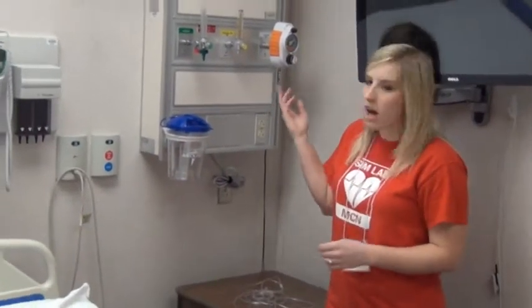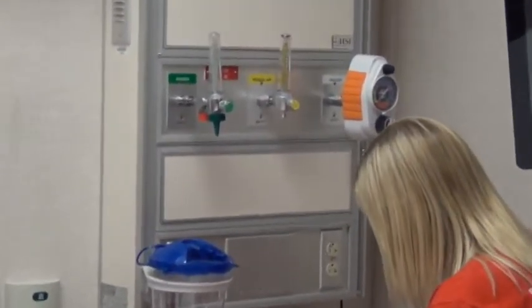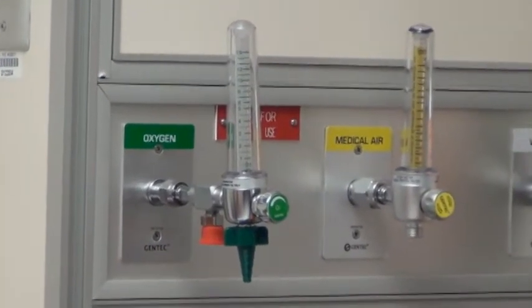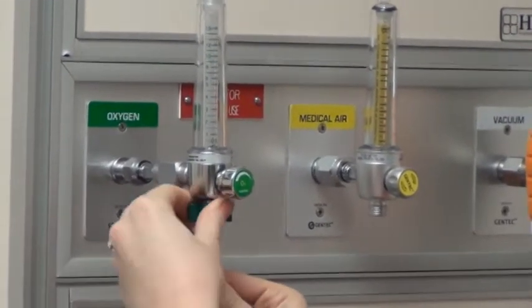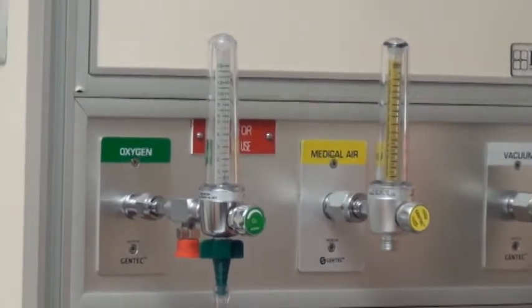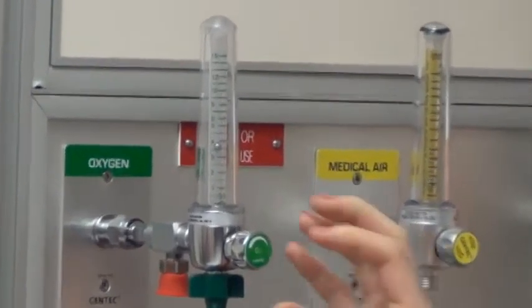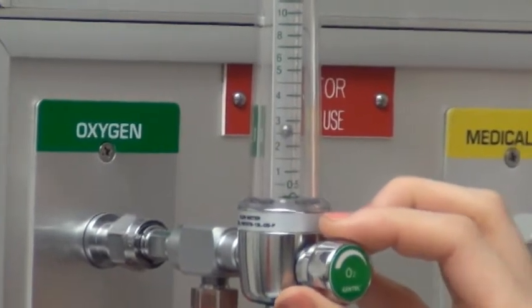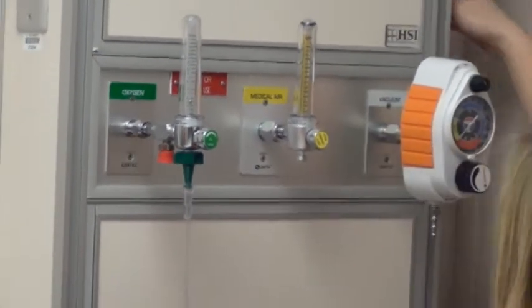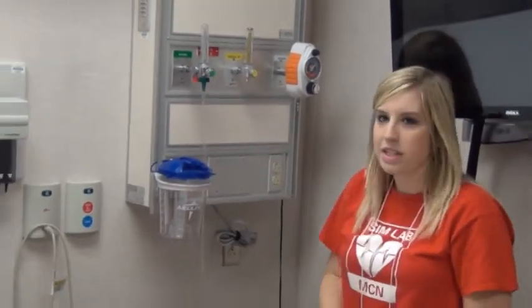Over here we have our oxygen and suction equipment. So if your patient requires oxygen, and if it's by nasal cannula or mask, you'll connect it here. And then you'll turn it on by the little button over here and you'll turn it clockwise. You'll hear it come on and then you can titrate to the orders that they're given and then place it on your patient. And then here is the suction equipment in case you were to need that in any scenario.